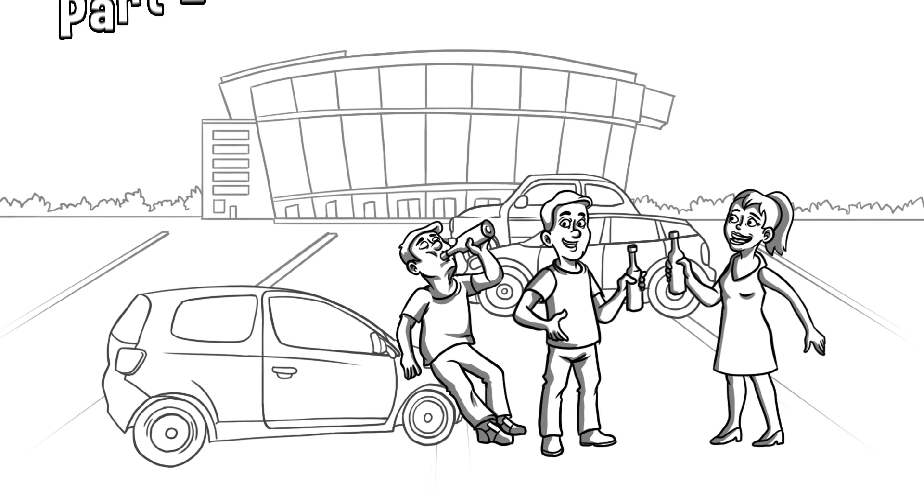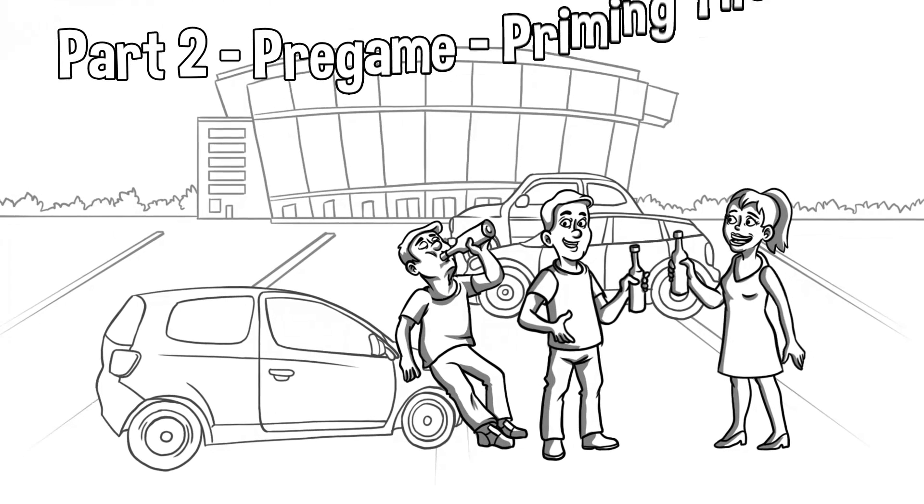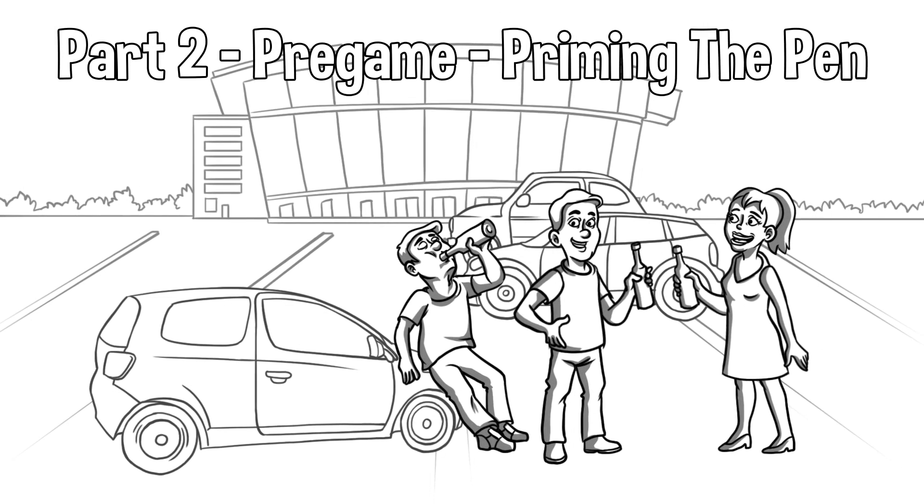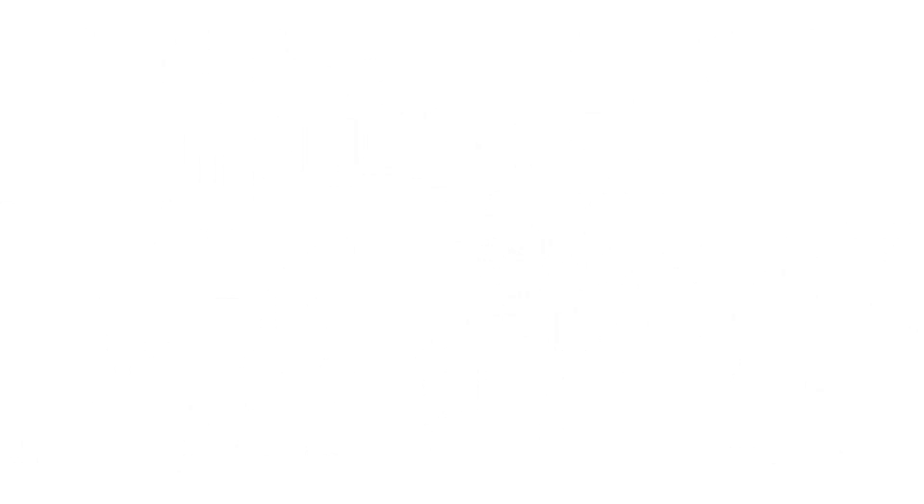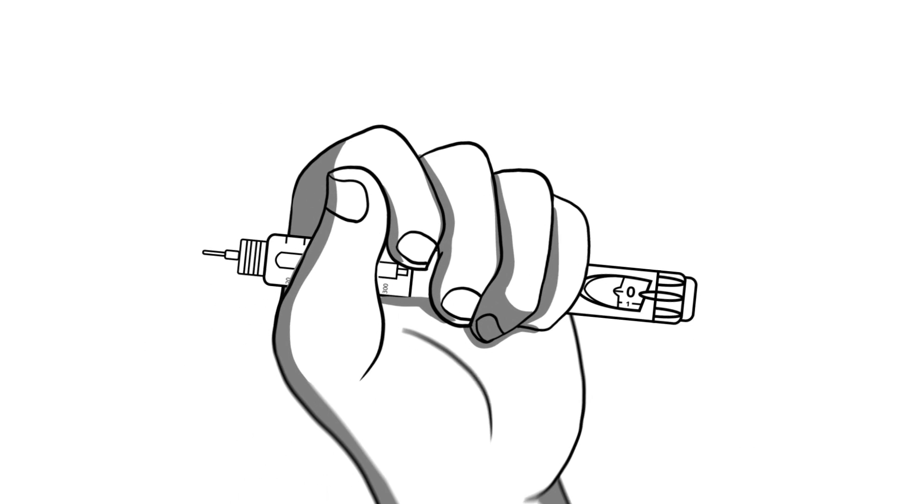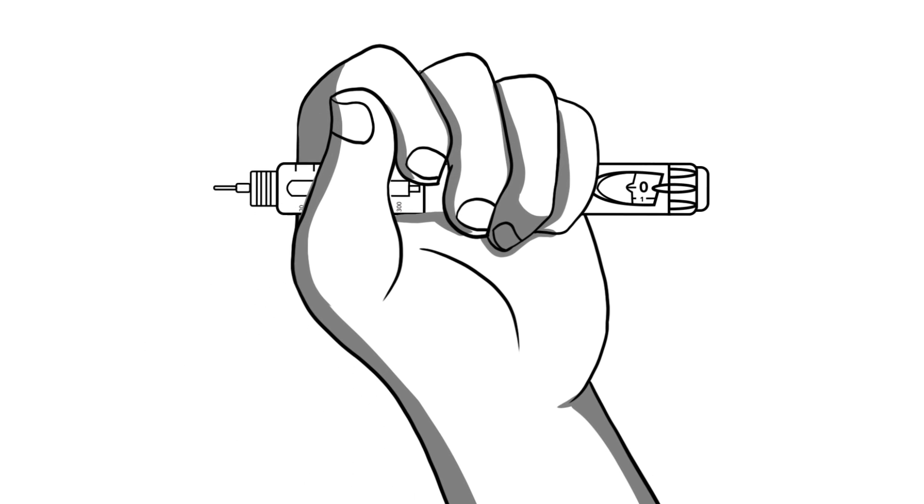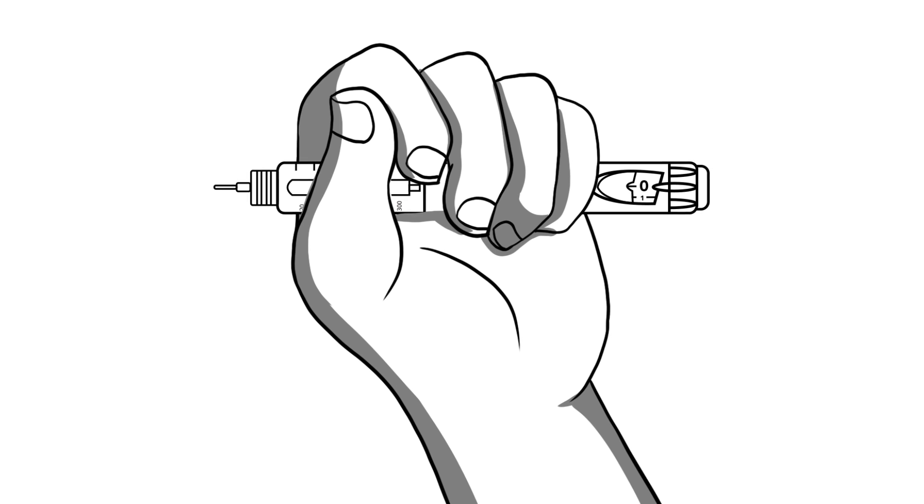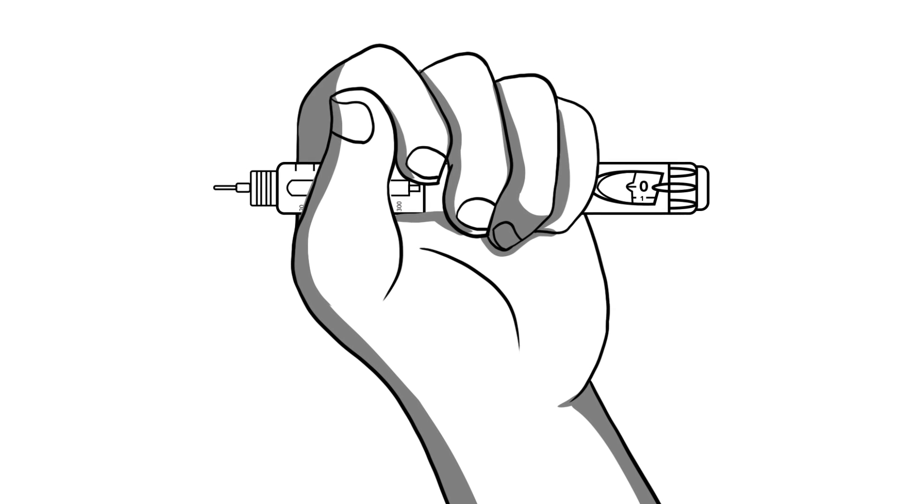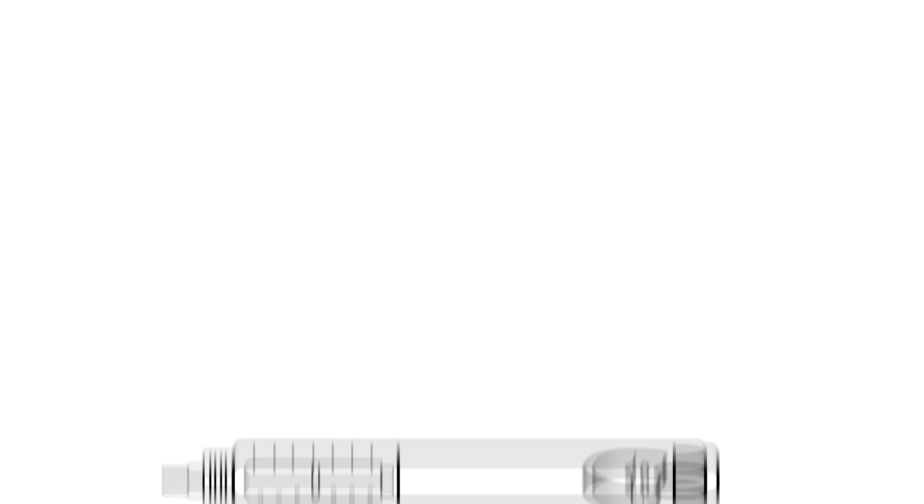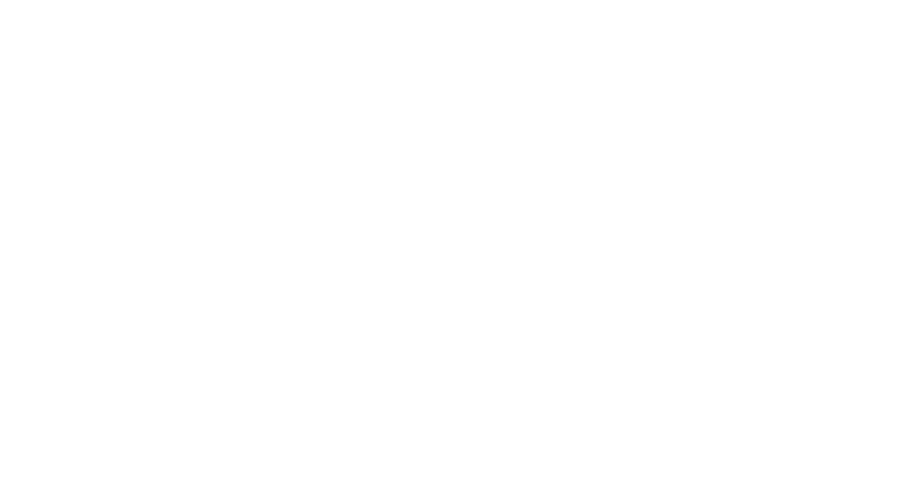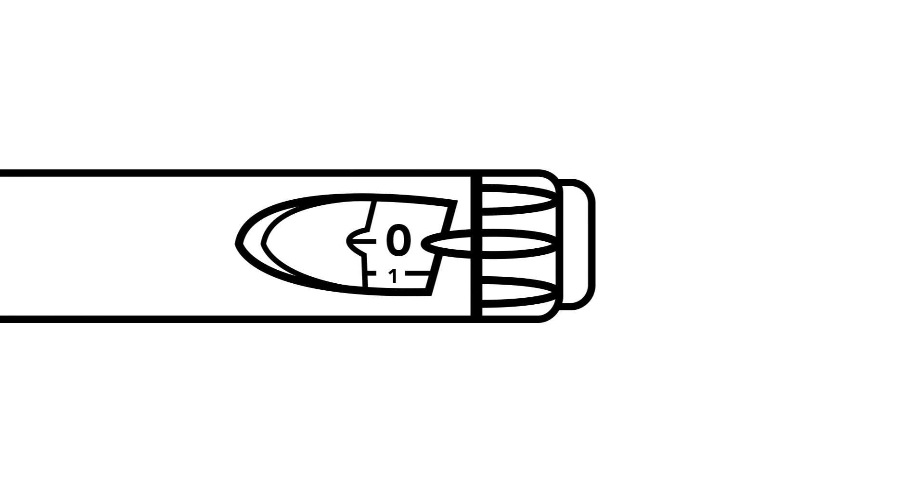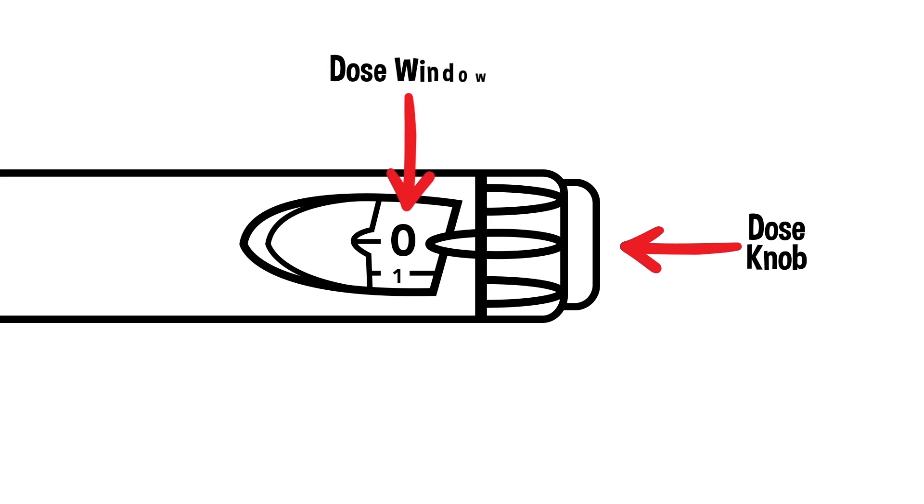Part 2. Priming the Pen. If you are right-handed, hold the pen in front of you with your left hand. The attached needle should be pointing to the left. Reverse this if you are left-handed. Let's move our focus to the side opposite the needle, where the clicker button would be on a ballpoint pen. There is a small window next to the dial. This is appropriately called the dose window.